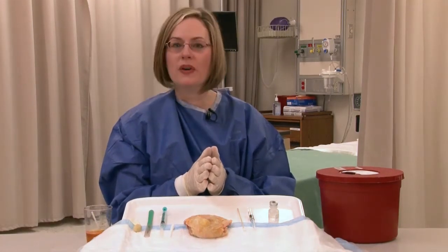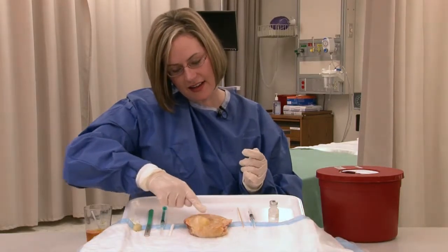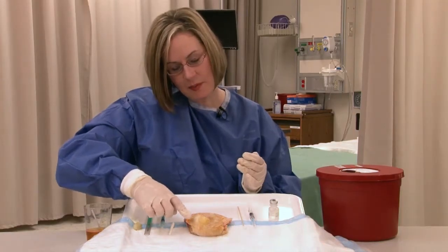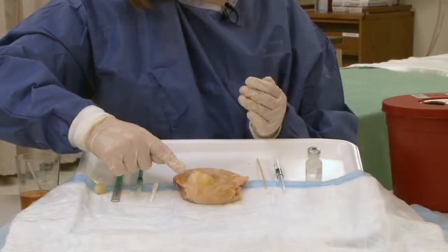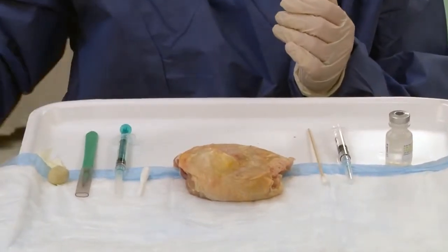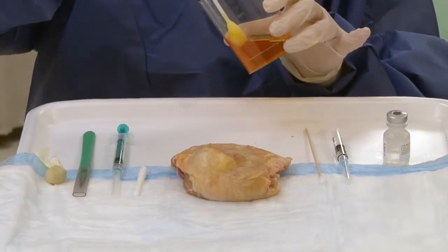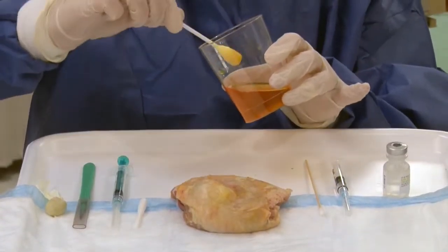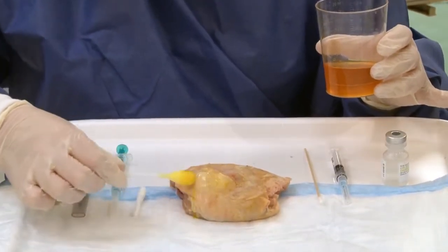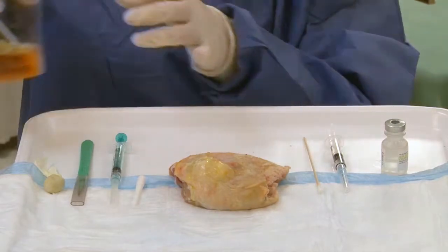Good lighting is important to be able to visualize the area of the Bartholin gland abscess. Inside of the labia minora, that is where the incision should be made, so that is where the area should first be cleaned. All right, clean the area.